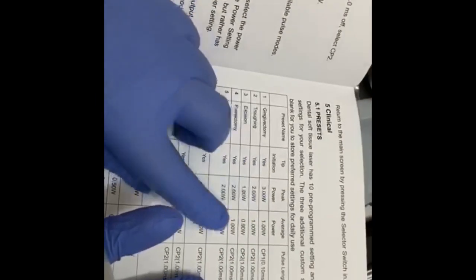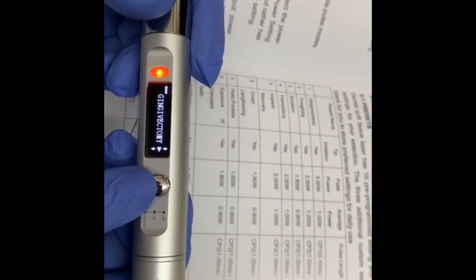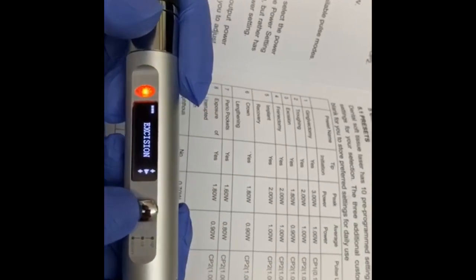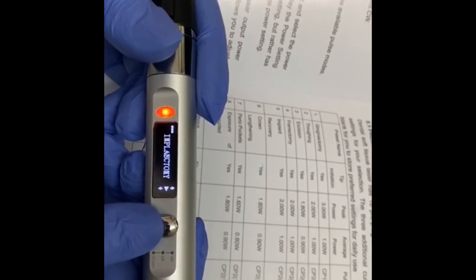So I think everything is preset over here in this pen. If I push this up you can see it is written gingivectomy, then excision, then frenectomy, then implant recovery, then crown lengthening, then perio pockets, exposure of unerupted teeth, hemostasis.